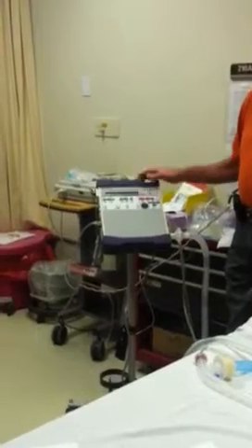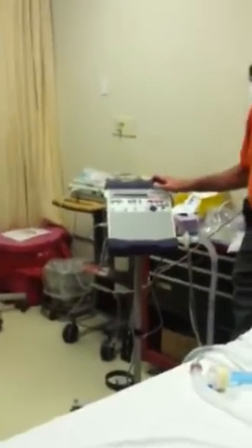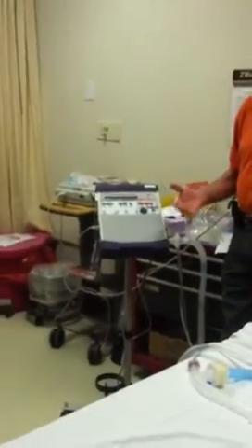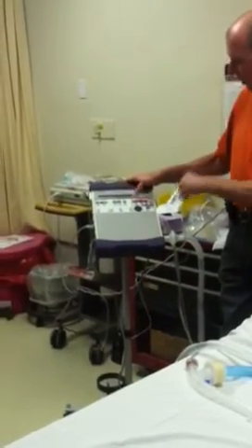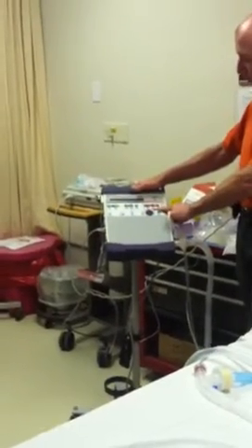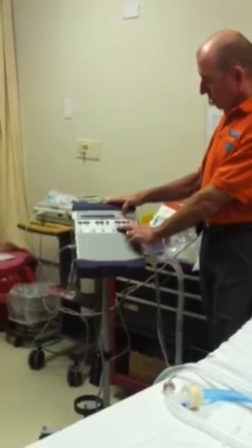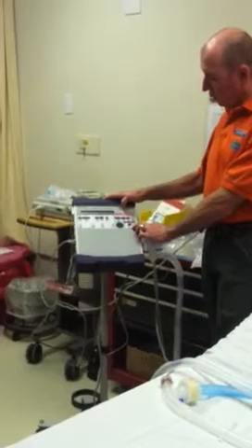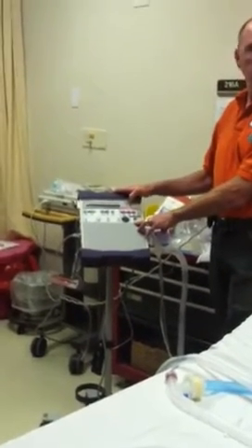Okay. Now the next thing is going to be your alarms. The reason the high pressure alarm keeps going off is because that's a stiff lung, and you're getting a lot of pressure in there. On a patient, we're not going to be getting as much. So when we go to set the alarms, the 3 alarms that we're going to set here are the low minute volume alarm, which we usually keep around 2 to 2.5.